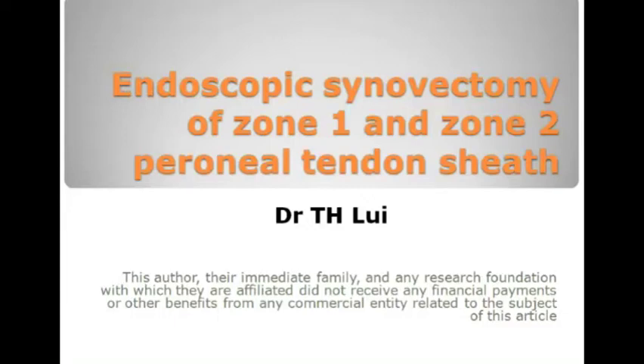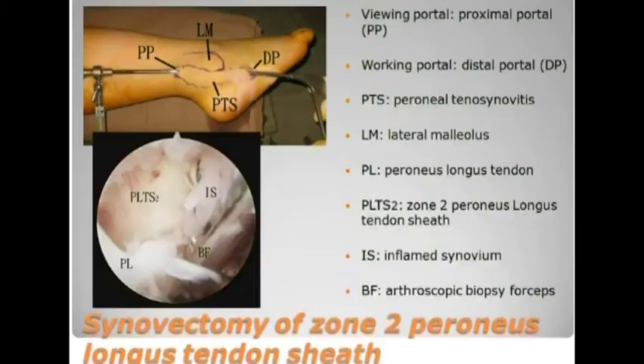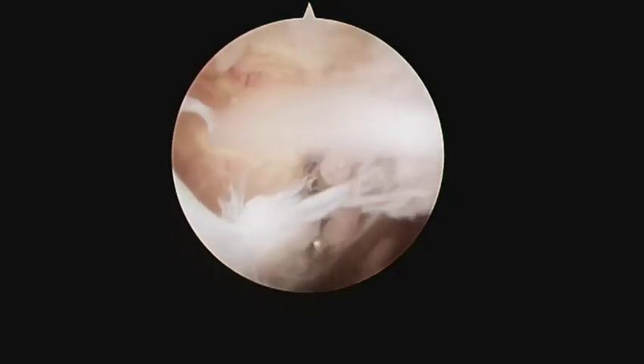Endoscopic synovectomy of zone 1 and zone 2 peroneal tendon sheath. This is performed through the distal and proximal portals at the distal and proximal end of the tendon sheath.